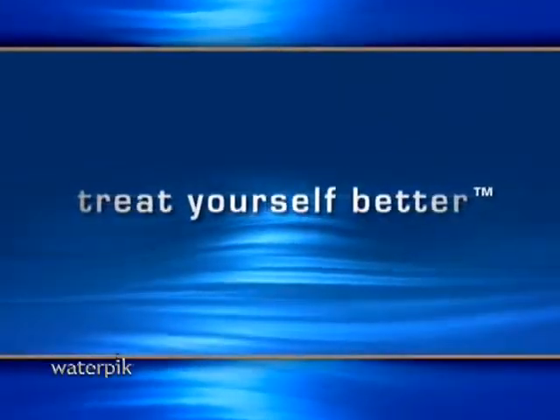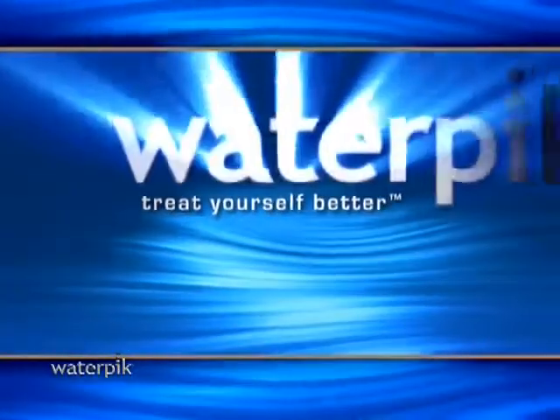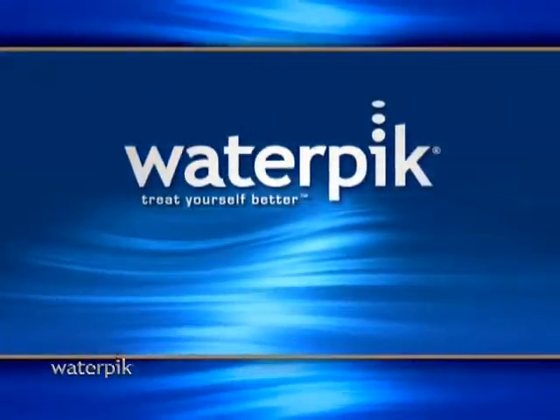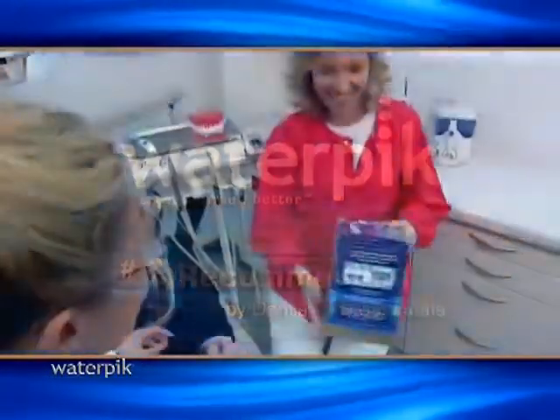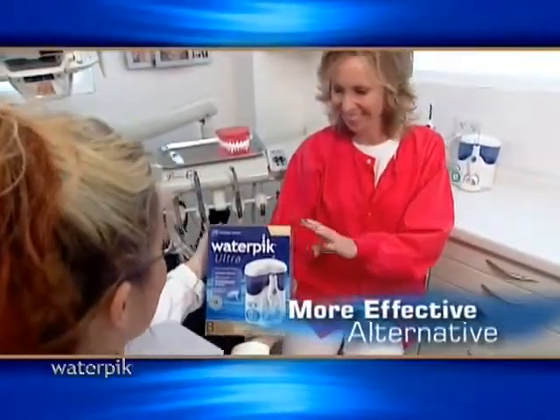Isn't it time you started to treat yourself better? Now you can with Waterpik, the dental water jet recommended by dental professionals. It's the easy to use, proven, effective alternative.